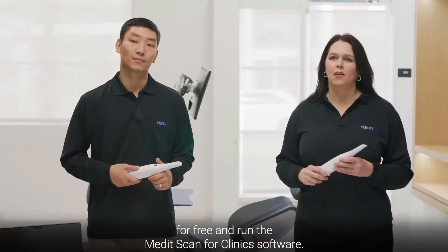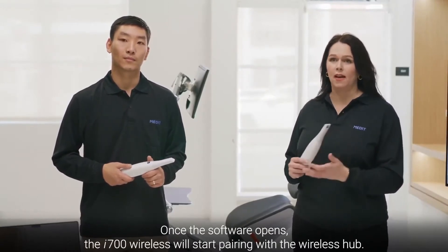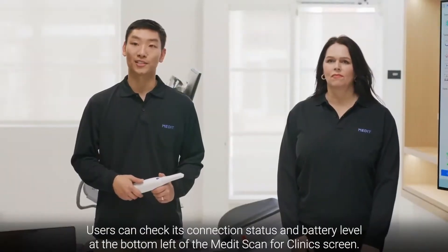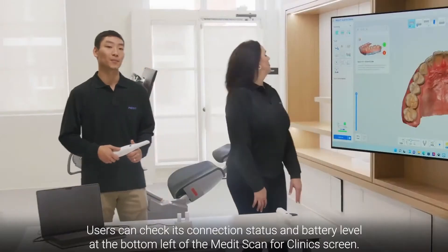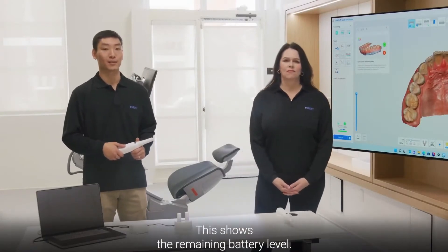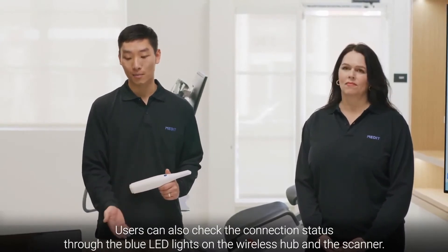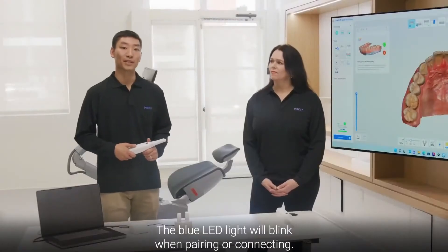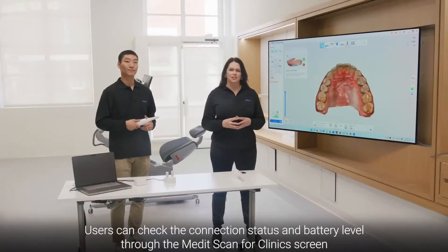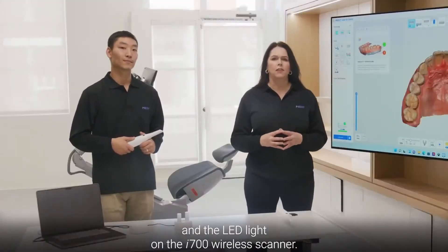Users can install MeditLink for free and run the MeditScan for Clinics software. Once the software opens, the i700 Wireless will start pairing with the wireless hub, which takes around 10 to 12 seconds. Users can check connection status and battery level at the bottom left of the MeditScan for Clinics screen. The blue LED lights on the wireless hub and scanner will blink when pairing and turn solid when the pairing process is complete.